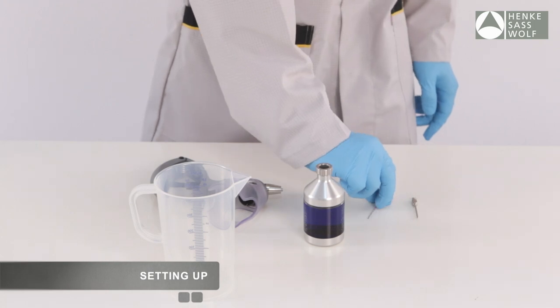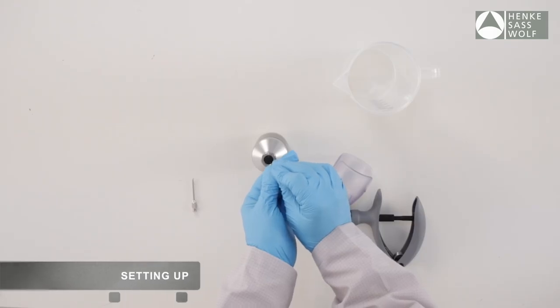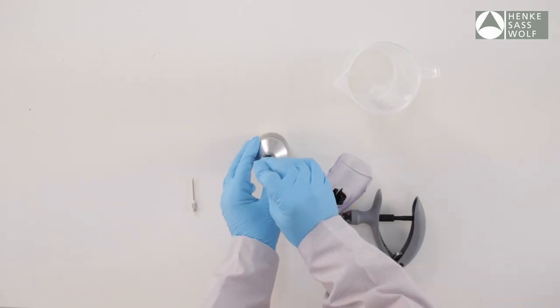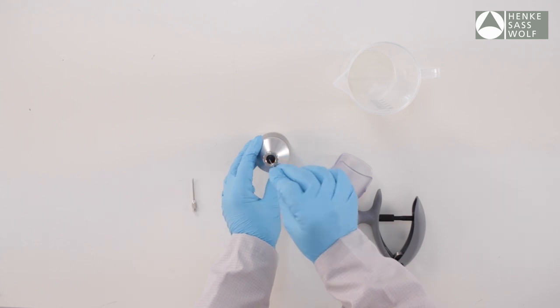At first, pierce the rubber cap of the bottle with a sterile needle before you attach the bottle onto the spike, making a pilot hole.